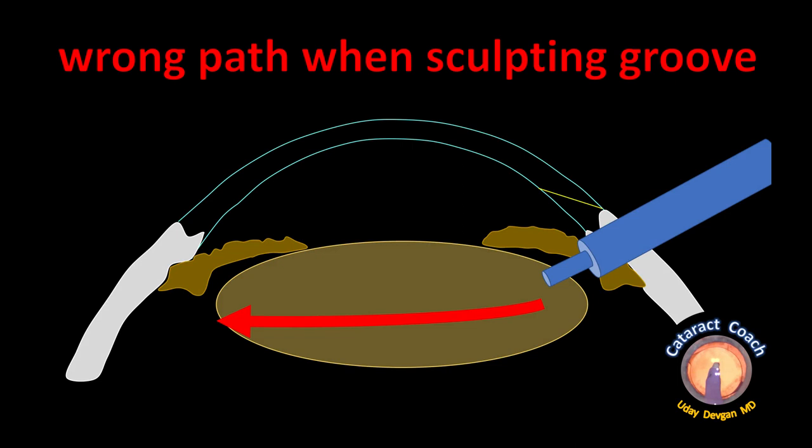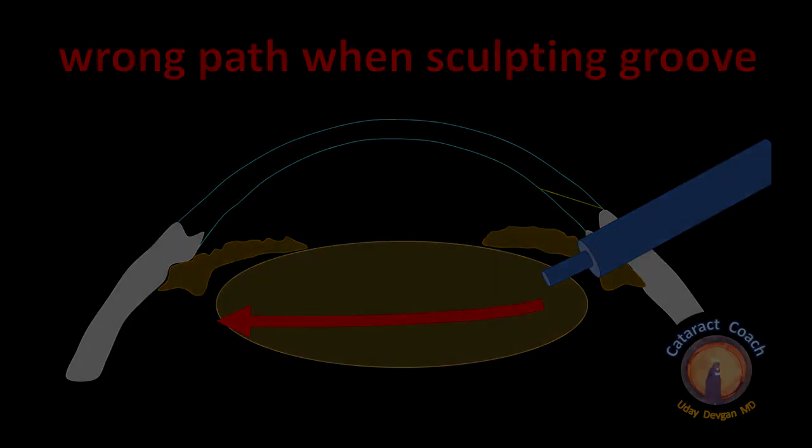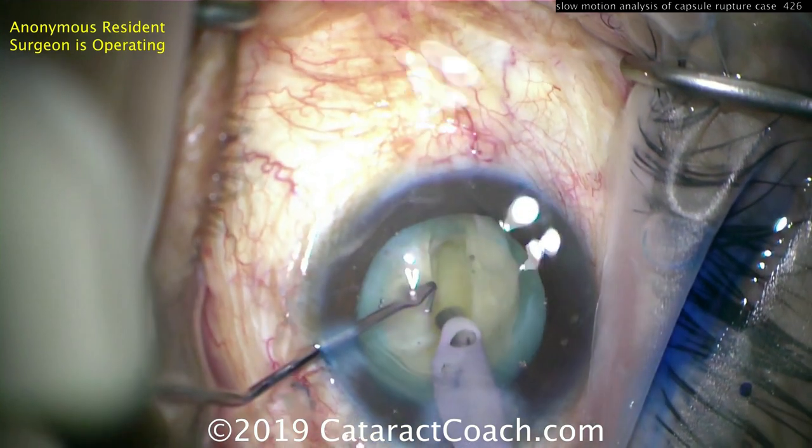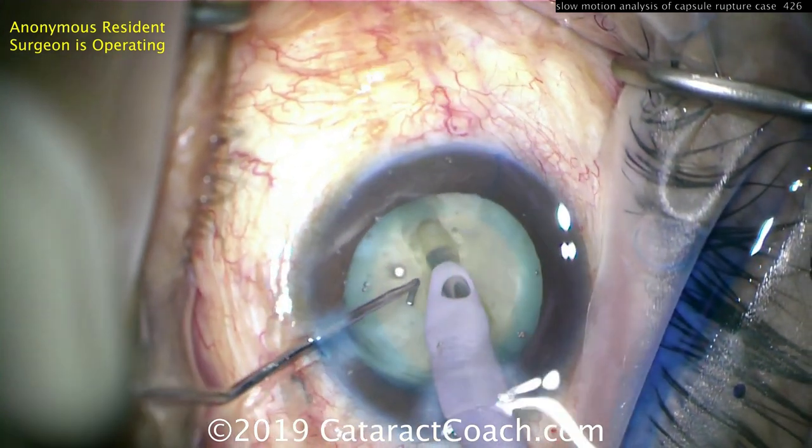So what was the problem here? The wrong path was used when sculpting the groove. Remember, the lens nucleus is thicker in the center and thinner in the periphery — like an M&M candy. This resident made the groove too far distal, hit the posterior capsule, and violated it — and that ended up being the issue.